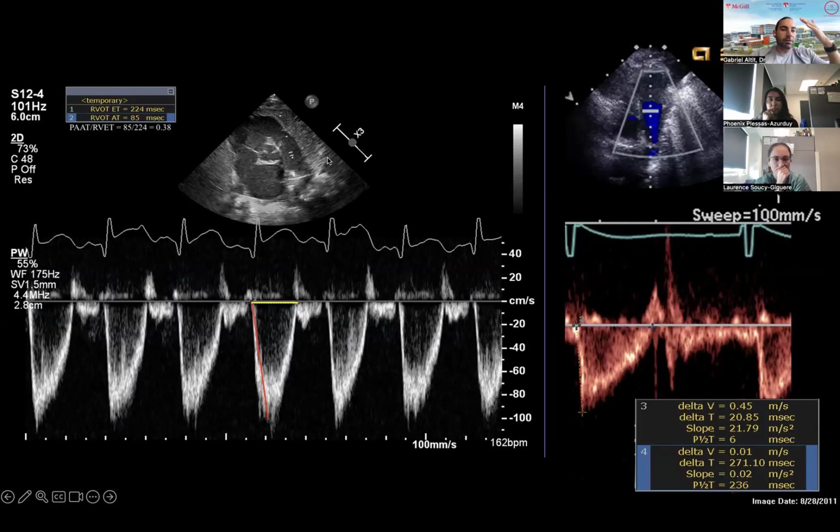So here is the left of the patient, this is the right of the patient, and this is your aorta. It's in the middle of the image. It looks like a Mercedes sign, but this is really the right side of the patient. So it's coming to the right of the pulmonary valve, of the pulmonary artery. And the pulmonary valve is more anterior compared to the aorta, which is in the middle. So the aorta is more posterior compared to the pulmonary artery.